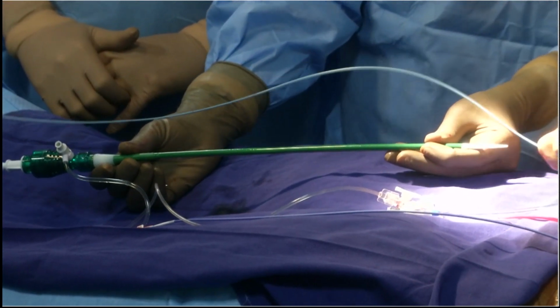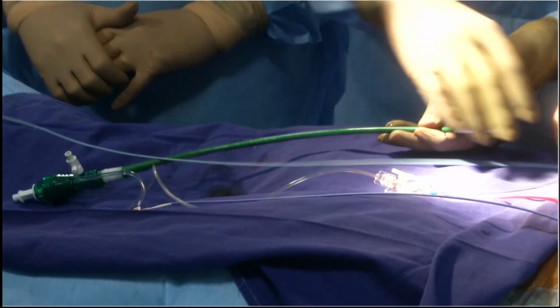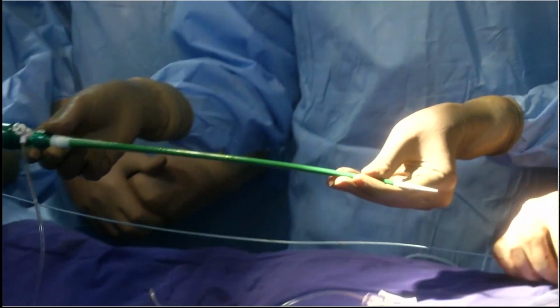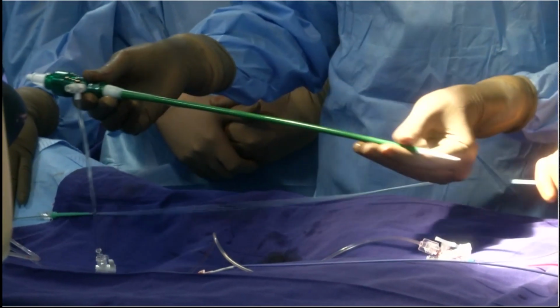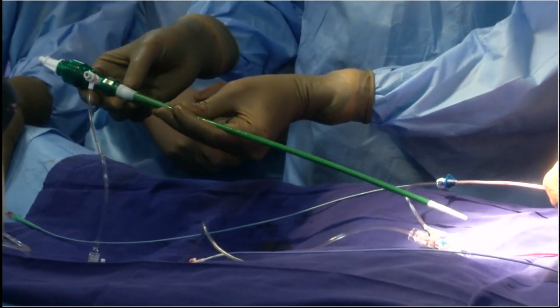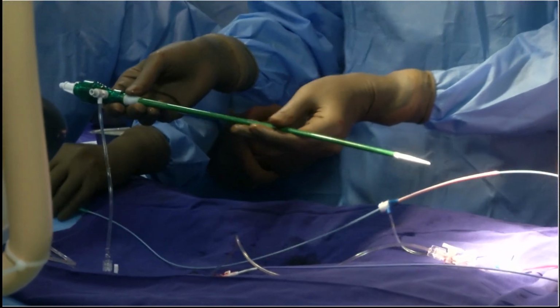Now Sengo is demonstrating the Python sheath. This is the expandable sheath, the Python sheath from Merit. You can see the green color sheath. Over that there's a dilator, and you have the Merit logo. Normally we make sure the Merit logo faces up.